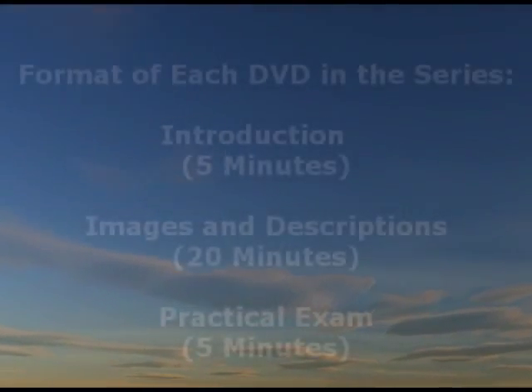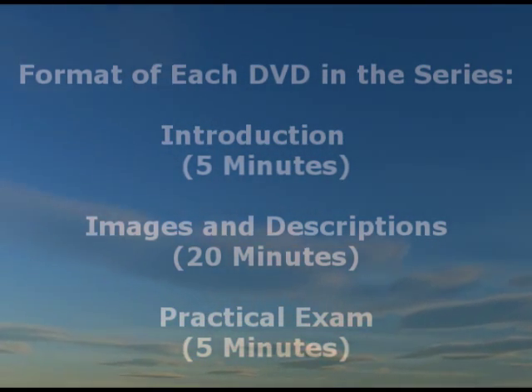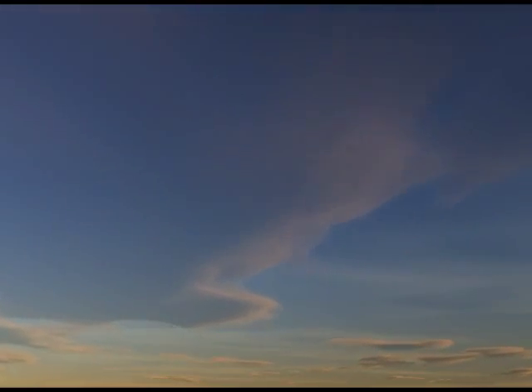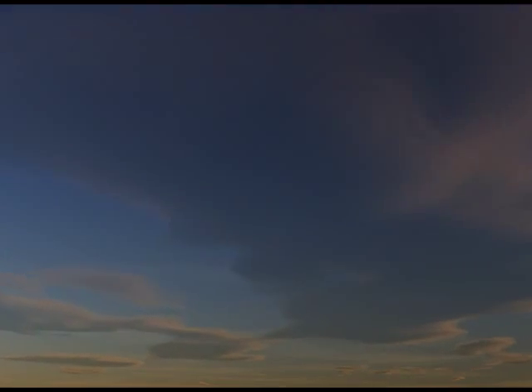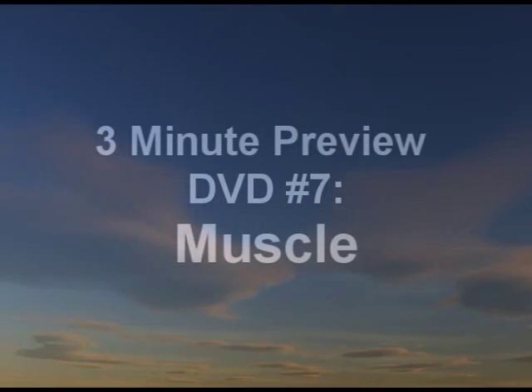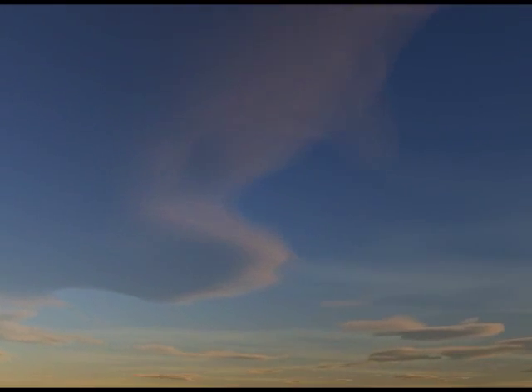We give you about a 5-minute introduction to the material, and then we describe images that you see with the light and electron microscope in some detail for about 20 minutes. And then we give you a 5-minute practical exam at the end so you can test your own knowledge and see what you've learned. Taken together, the 26 programs in the DVD series provide you with a complete basic course in histology. What we're going to do now is give you a 3-minute preview of program number 7, which is on muscle. And remember, this is a highly compressed preview because the whole program normally takes 30 minutes, and we'll just show you about 3 minutes of it.